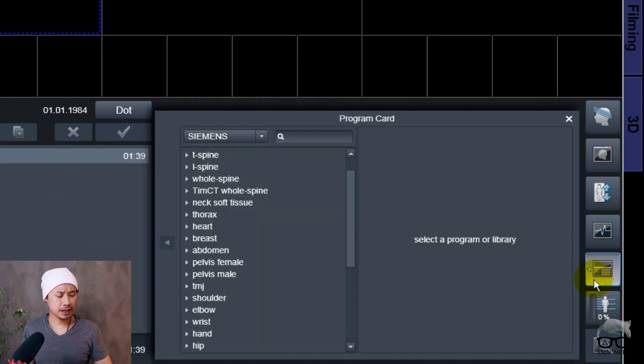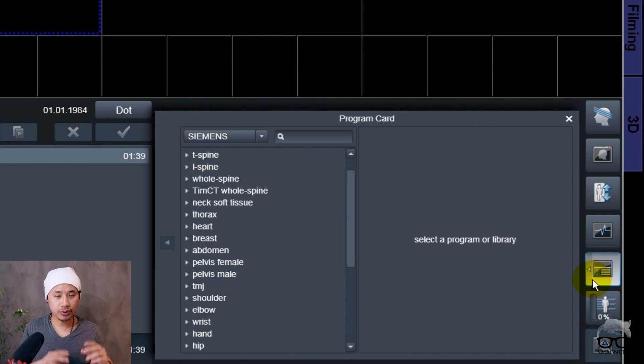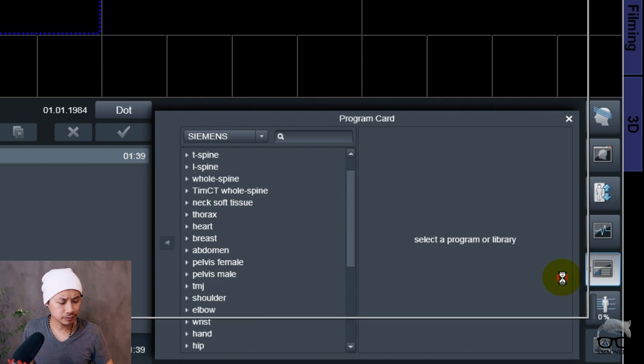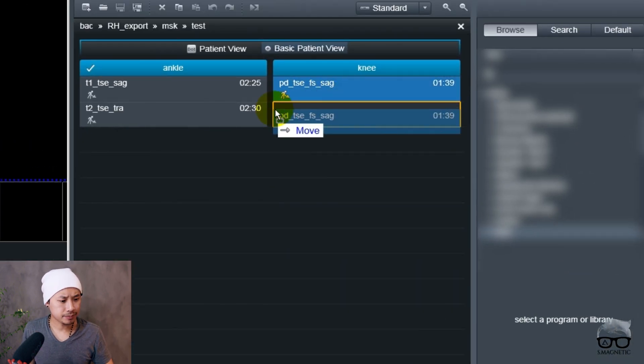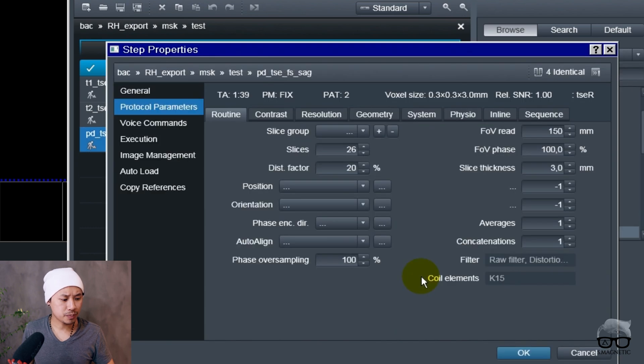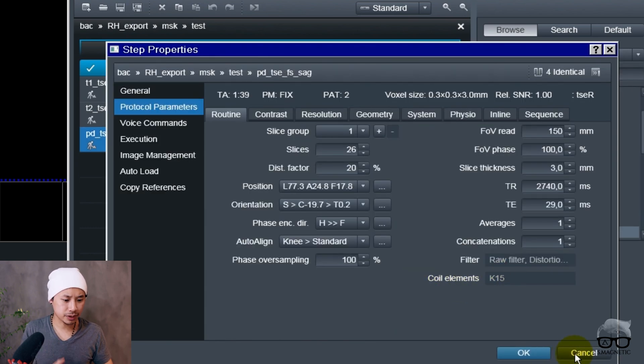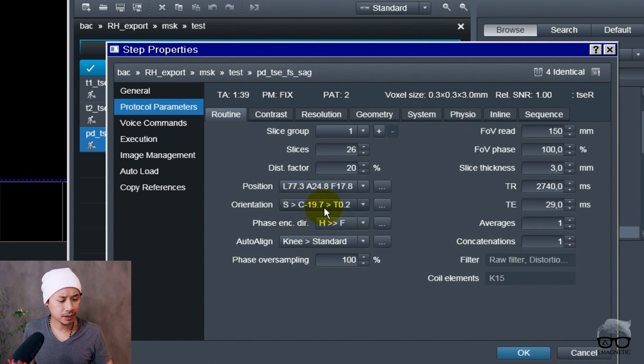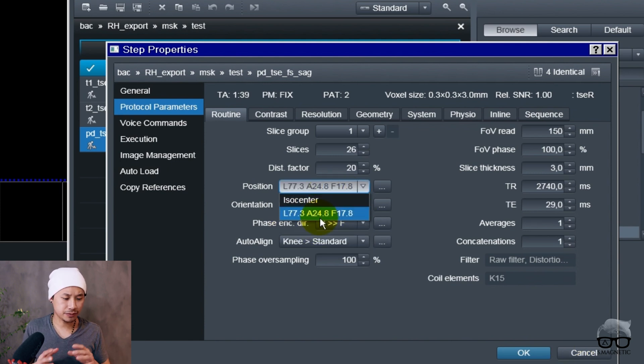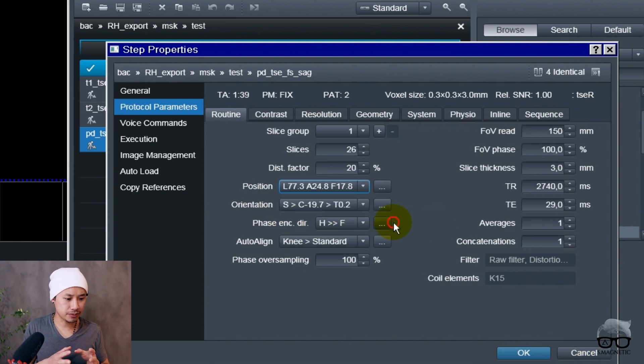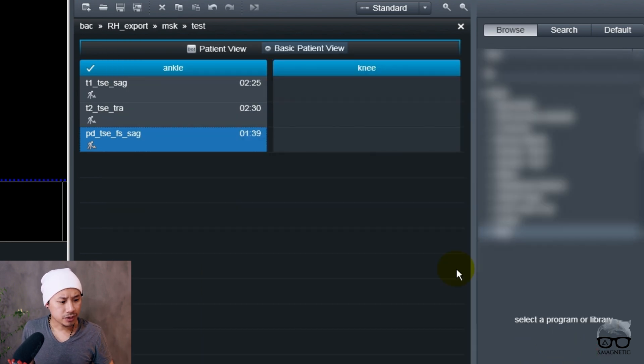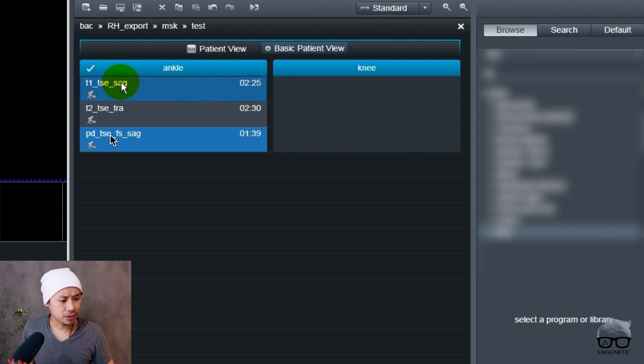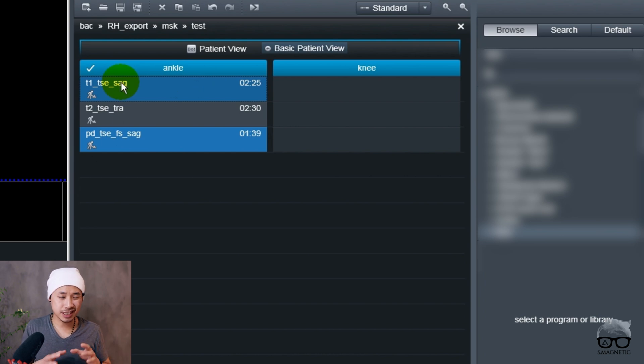Now you can run the protocol, run the sequence. Let's go in here again. Now I'll show you a faster technique. I'm just going to open this one to show you that it's saved to the knee coil and there's a different position for the knee, orientation and all that.